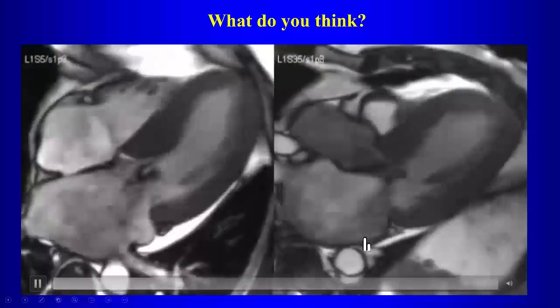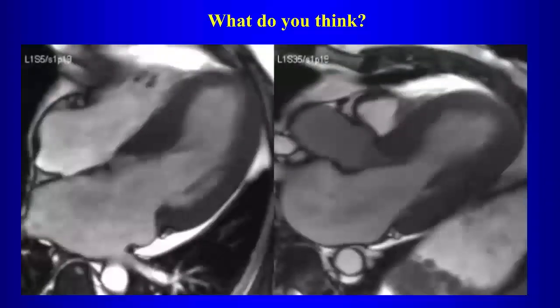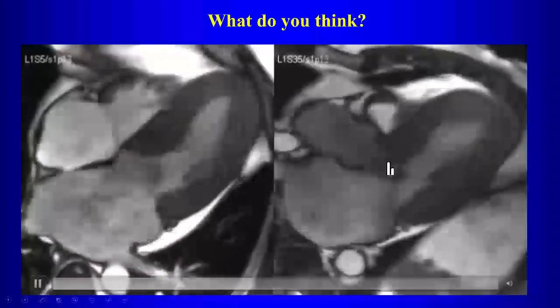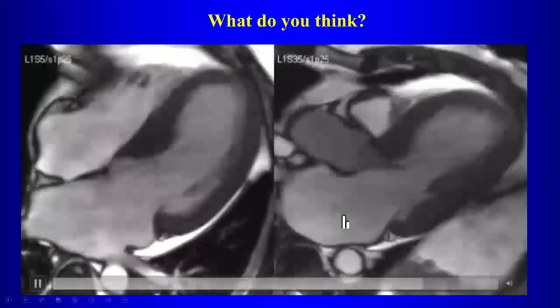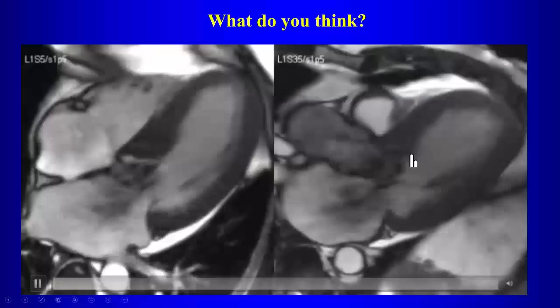Left ventricular hypertrophy. Okay, what would you look for? Septal thickening. So where there is a flow jet here, see it? Does that start below the aortic valve or above the aortic valve? Below. So what's the diagnosis? It's hypertrophic cardiomyopathy. Hypertrophic obstructive cardiomyopathy.